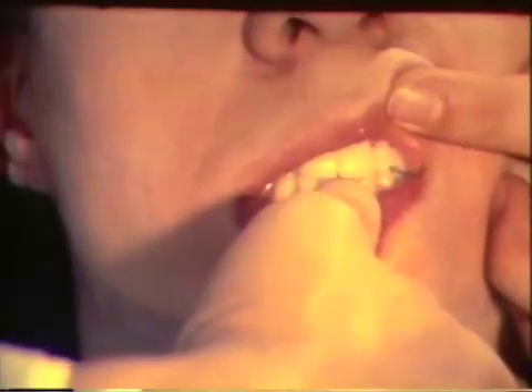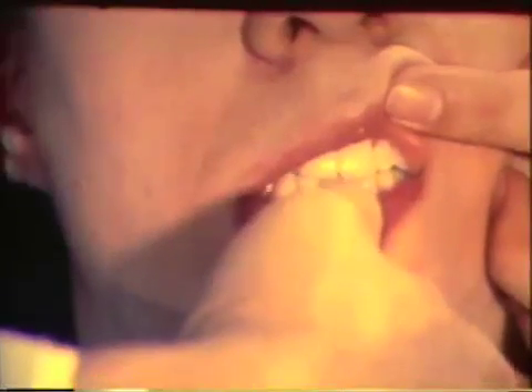A semi-direct method for constructing a bite plane will be illustrated. This method was described by Dr. Shulman in the Journal of Prosthetic Dentistry, March 1973.